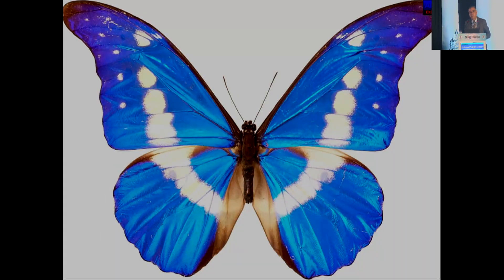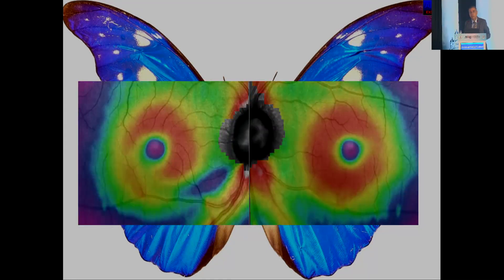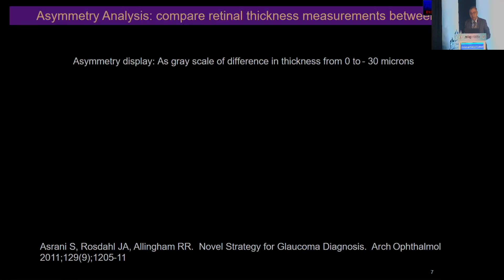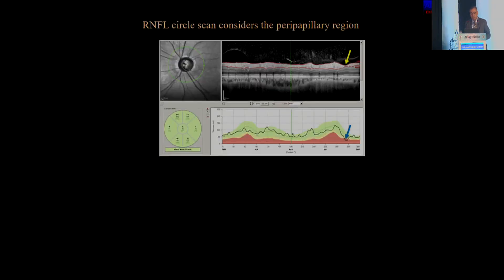We didn't have a normative database, so we took advantage of symmetry. Symmetry in nature means macular thickness is also symmetrical, and therefore any asymmetry is very easy to identify. If you look at the asymmetry, you get a display of the difference between the two eyes.